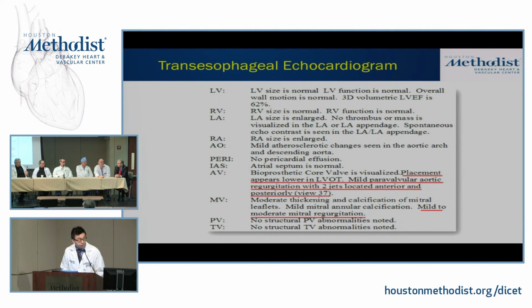You showed the MR briefly. How bad was the mitral regurgitation? So we concluded that the mitral regurgitation was mild to moderate. Mild, okay.